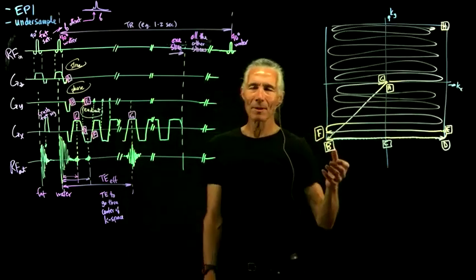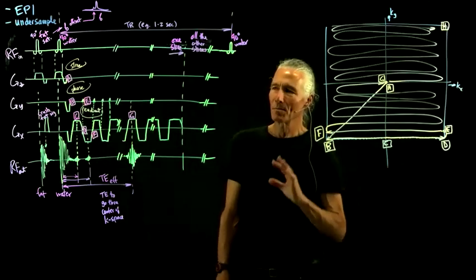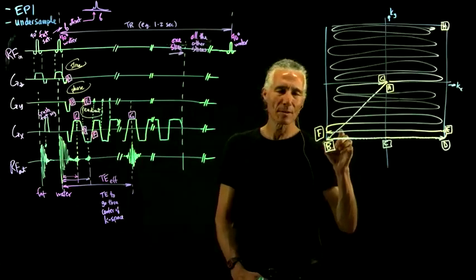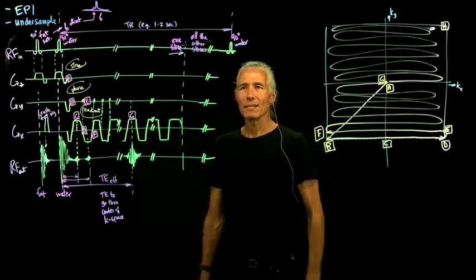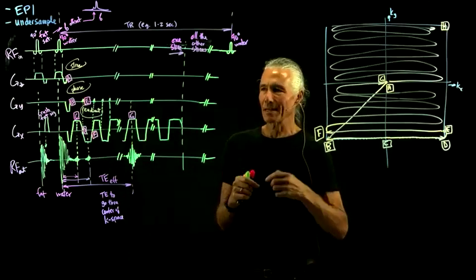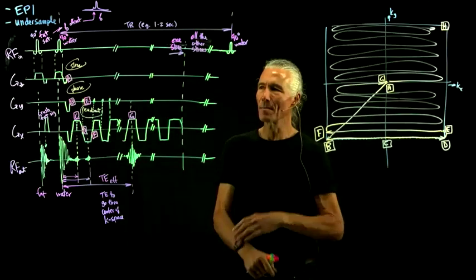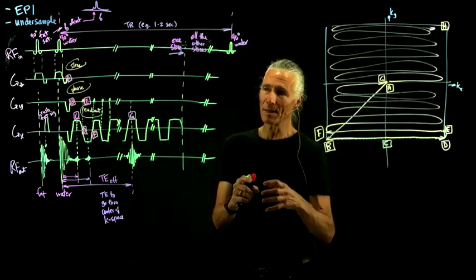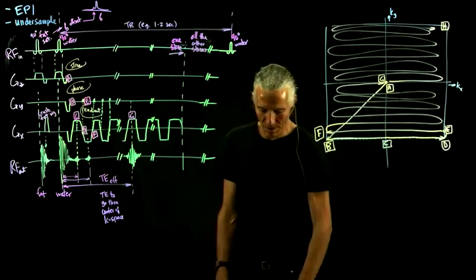It's a kind of sloppy imaging technique because we'll see that there's a lot of distortions in it. We'll try to explain why those distortions are there. It's a little complicated story to explain, so I'll do that next week. But the great advantage is that we can collect a whole volume of the brain in 1 second. And that's the only way to do functional MRI, where you're looking at changes over time due to changes in blood oxygenation, which are caused by changes in activity. Those changes are happening second to second, and so we need to be able to record very quickly.